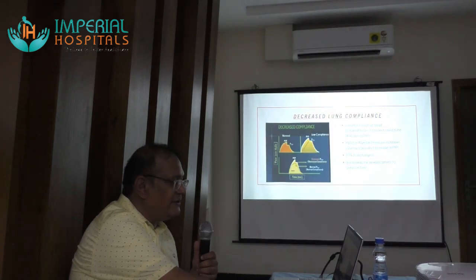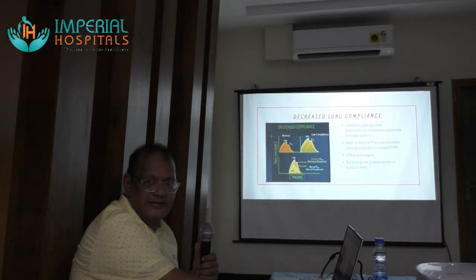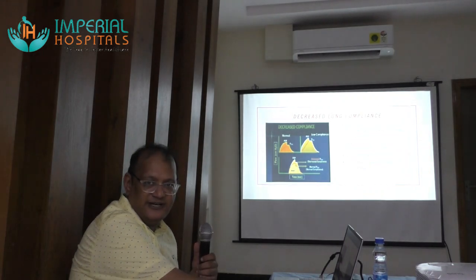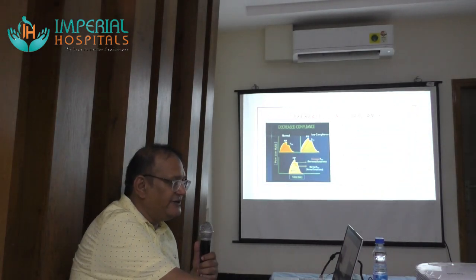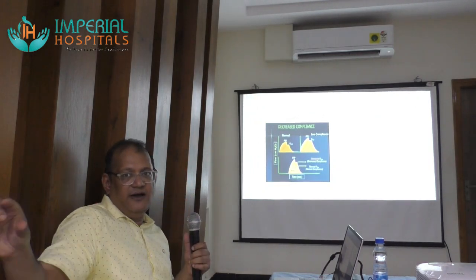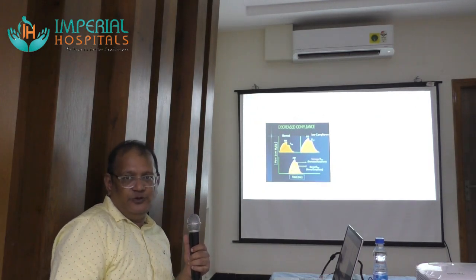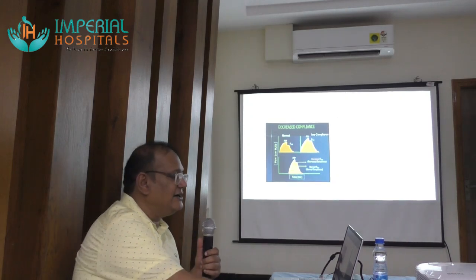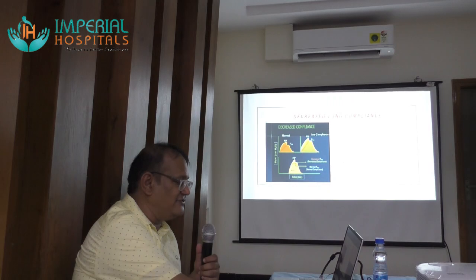But if the peak inspiratory pressures are elevated, and the alveolar plateau pressures are also increased, and there is no difference in the resistance, that means there is no problem in the pathway or tubings. The problem is in the alveolar compliance. So in these cases, doing suctioning will not be really useful.